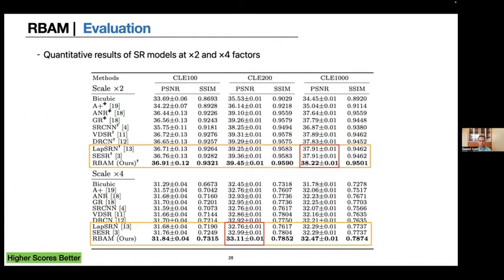And we highlight the numerical comparisons for 3 methods based on deep learning approaches. The red boxes indicate that our network can improve the final image quality in terms of PSNR across different data sets and scales.